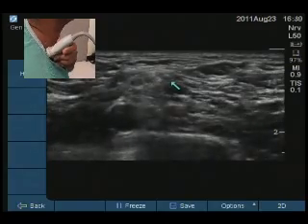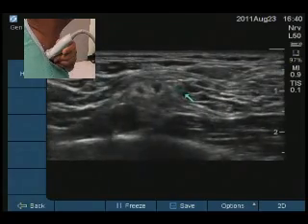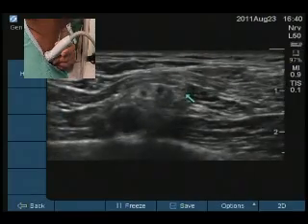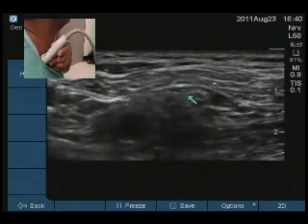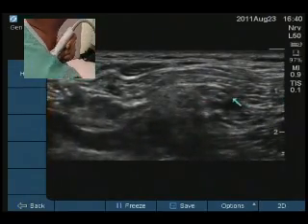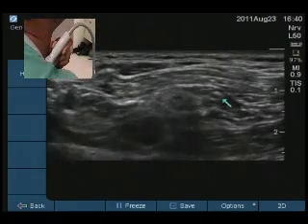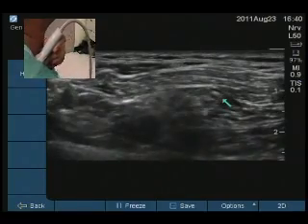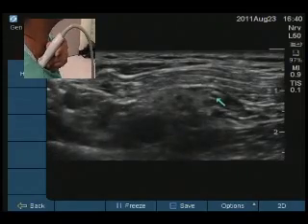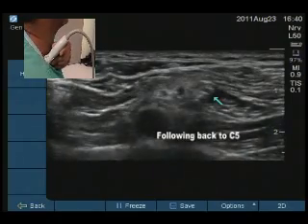Okay, move the arrow away slightly. Yeah, that's it. Going further down. And then. Falling — super, back to the neck now. Okay. Just don't fall in there.